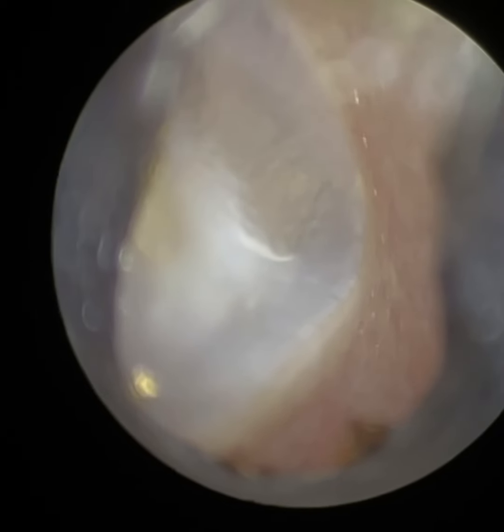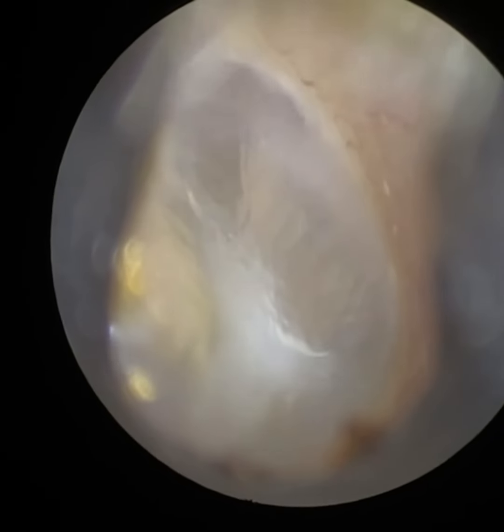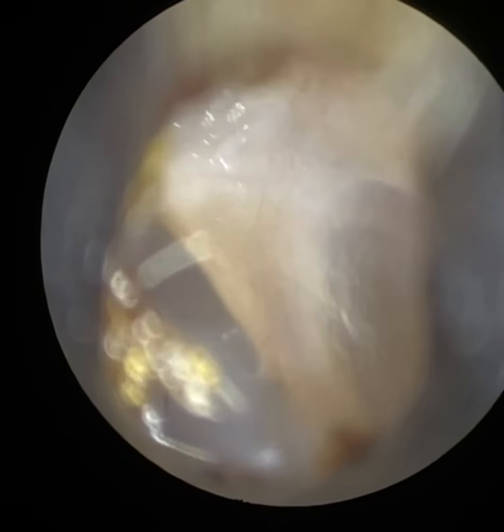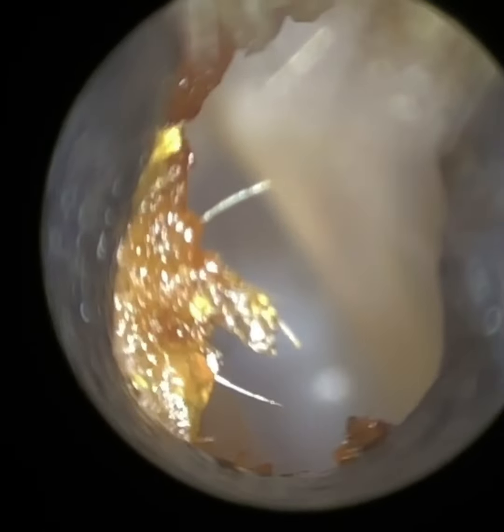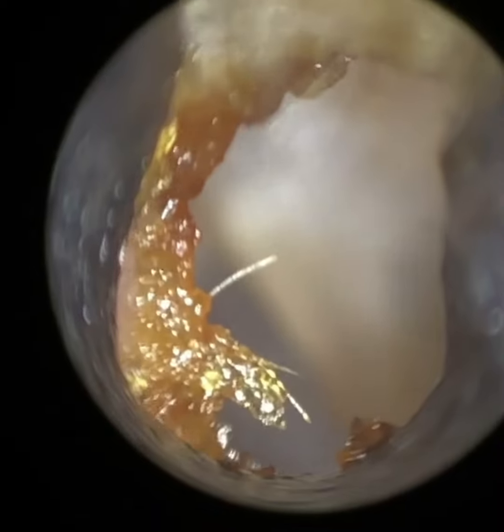You can see we've removed the occlusion. I'm just moving a bit of keratin on the anterior lateral canal wall, and that's all but clear now. We're going to change the focus and visualise the eardrum. I'm just going to remove a bit more keratin so we get a fuller view. You can see the magnification — I've just adjusted the focus on this keratin, which is on the front part of the ear canal and also the roof. We're very lateral, near the entrance.